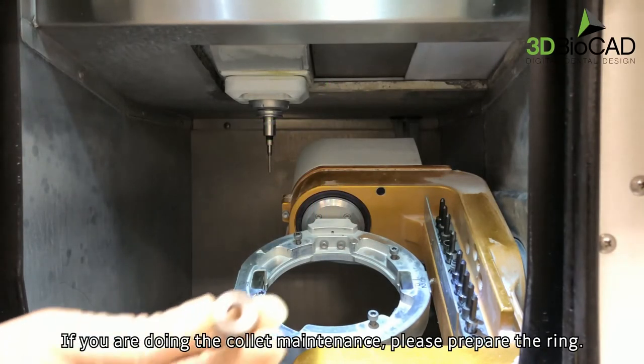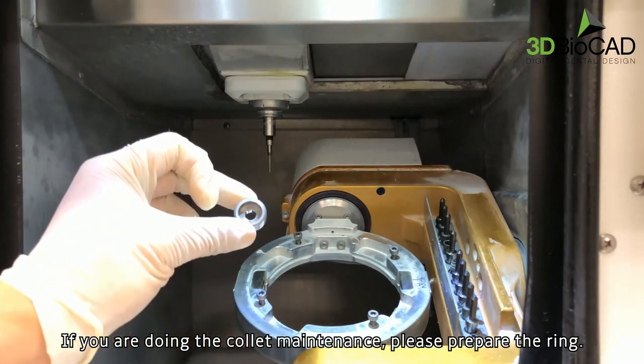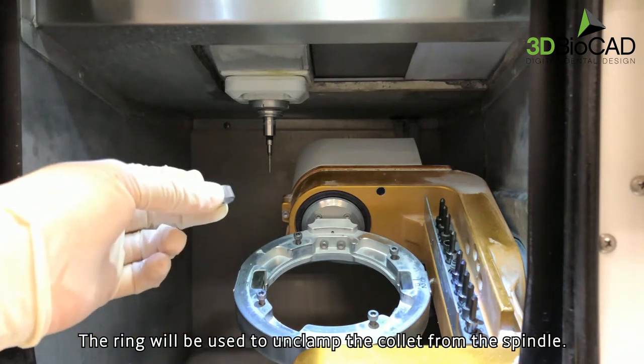If you are doing the collet maintenance, please prepare the ring. The ring will be used to unclamp the collet from the spindle.